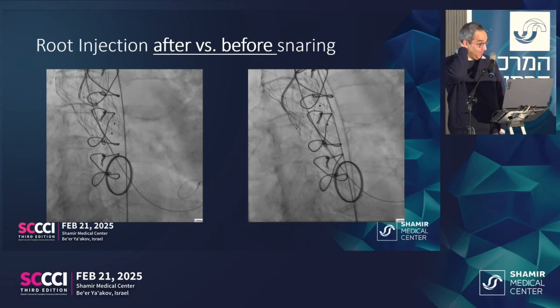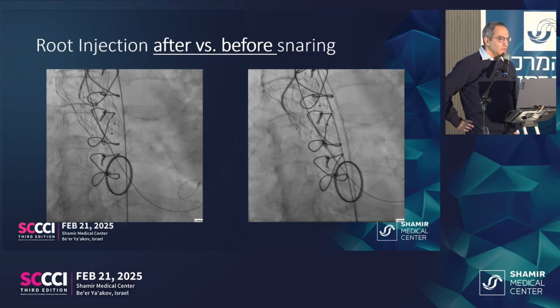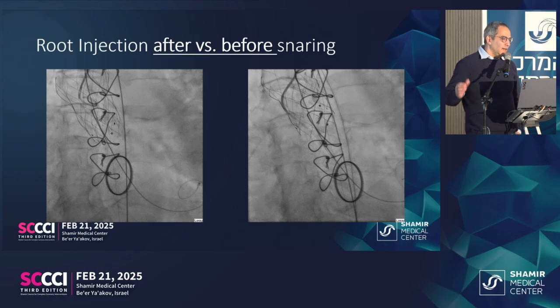Elad? Yeah. What was the calcium score of the valve before? Was it a rheumatic valve? No, it wasn't. I showed the pictures. It wasn't too calcified. Yeah. That's my question. How do we prepare for a non-calcified valve when we need to implant at an exact location? I had a similar case just the other day, and it jumped in. I'm saying, how can we be better prepared for a non-calcified annulus?